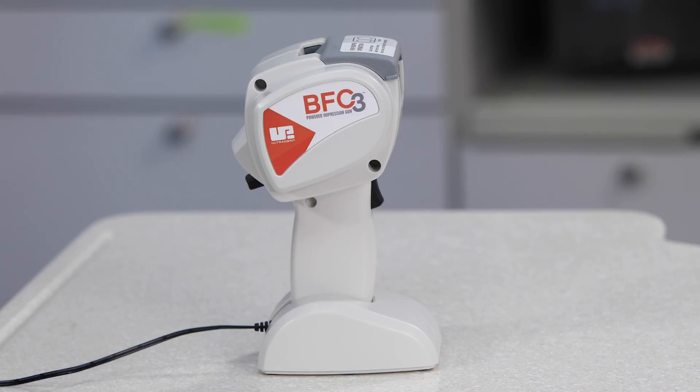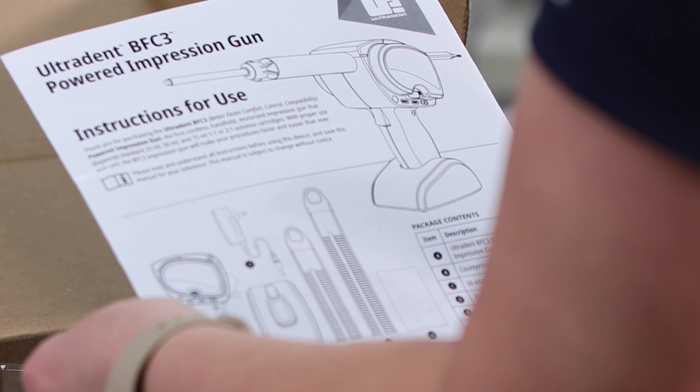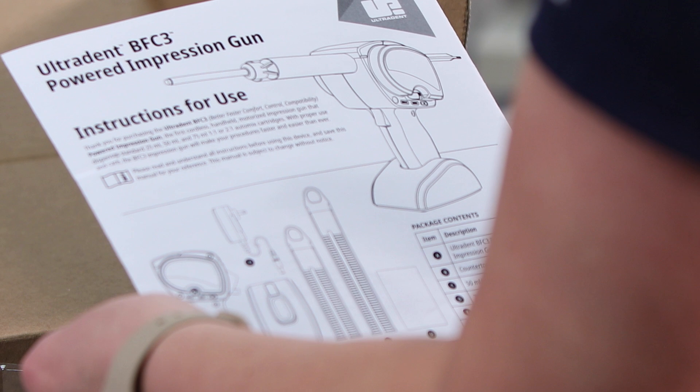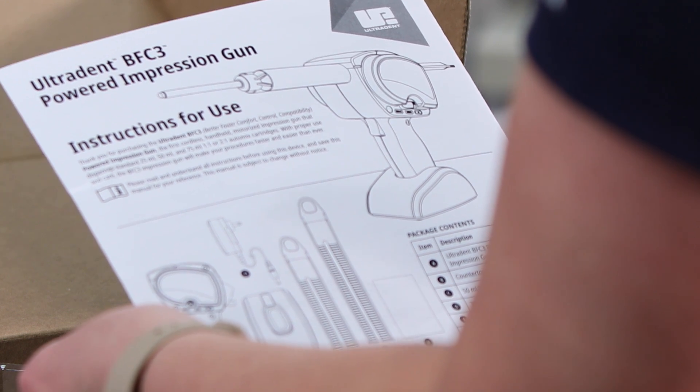It is not harmful to store the BFC3 uncharged. Should your Ultradent BFC3 powered Impression Gun not perform as expected, please refer to the printed instructions and support contact information included with your BFC3 Impression Gun.